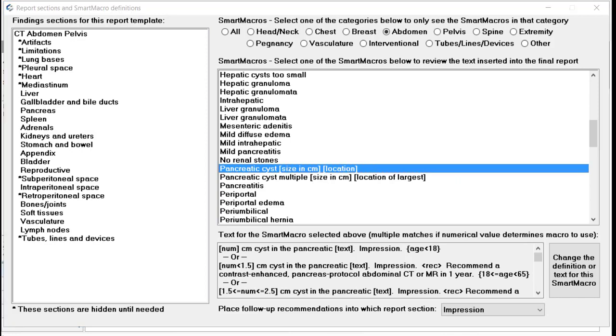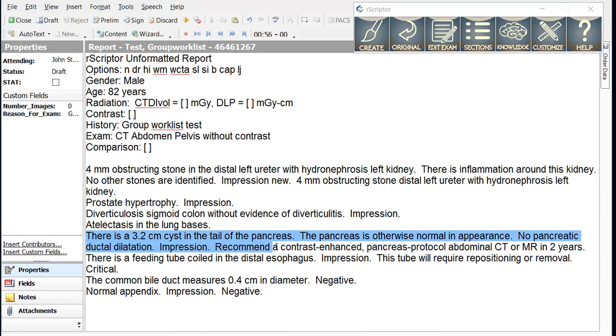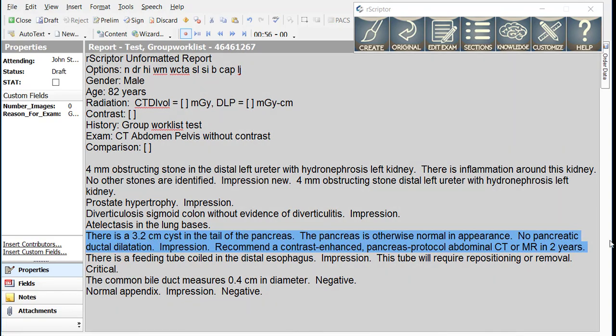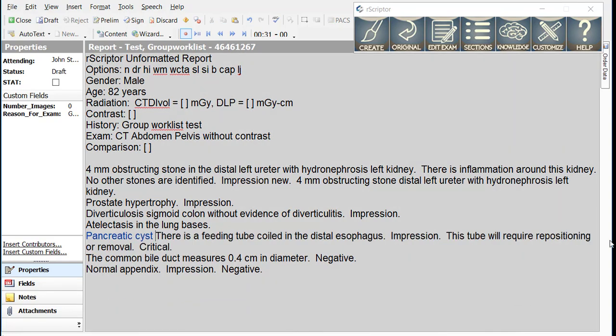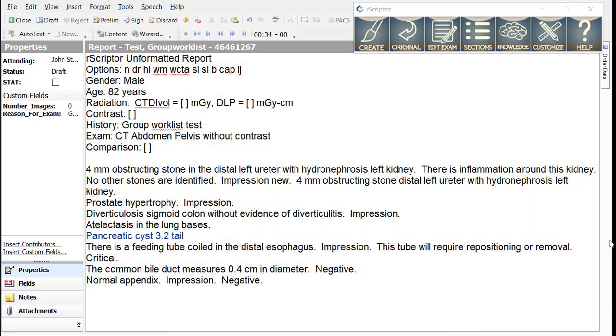Now let's insert a couple of smart macros into our dictation. For the pancreatic cyst, we could simply dictate pancreatic cyst 3.2 tail. Next line. Note that for a smart macro, we do not use punctuation at the end of the sentence. So we would leave the period off the end of that sentence which tells R-Scripter you are attempting to use a smart macro.